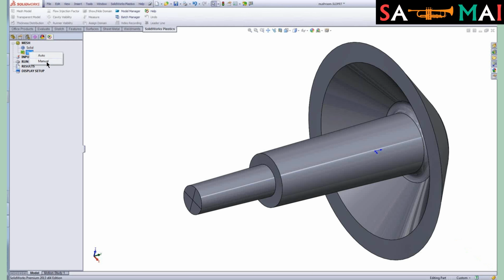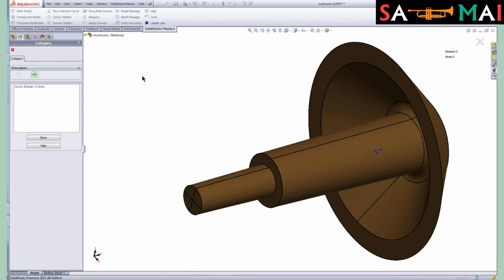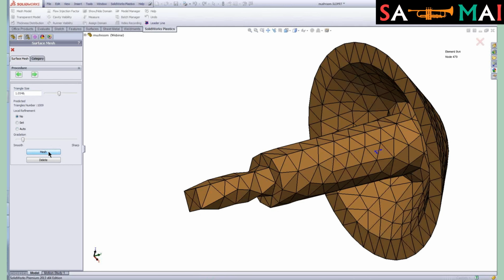What I'm going to do is, first step, just create a shell mesh on this part. A shell mesh is nothing more than a surface mesh around the entire surface area of this part. It's a great way to do a first pass analysis, just to help get us started with analyzing our injection mold flow of the plastics part. So as I start this, you'll see I have a triangle size. This would be analogous to the mesh size that we would do in finite element analysis. If I click the mesh button, very quickly I get a representation of the surface of the part.